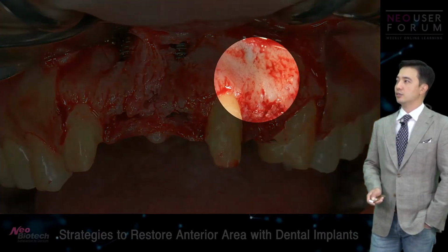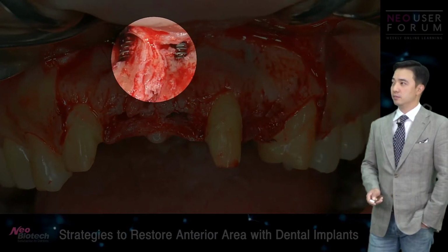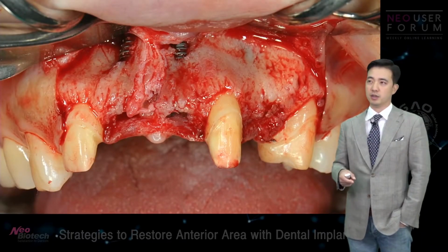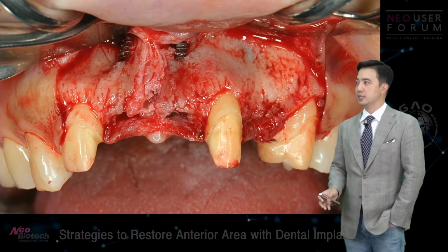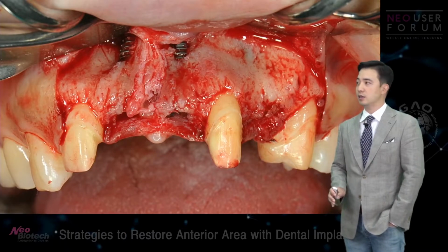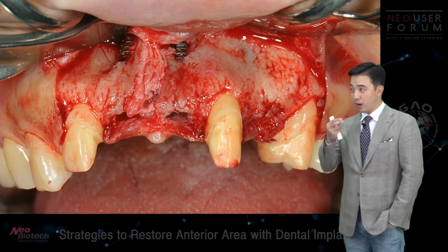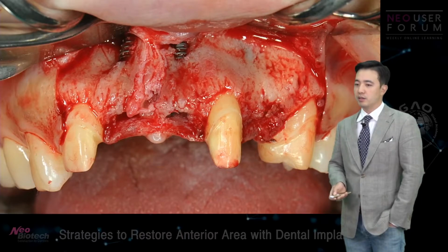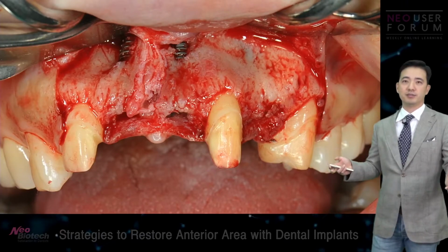As you look here, as we planned the implant, the apex just came out of the alveolar bone, and I didn't really get surprised because I knew the implants were going to come out this way. The problem, however, was the amount of flap that I raised. It looked like this gigantic flap, right?